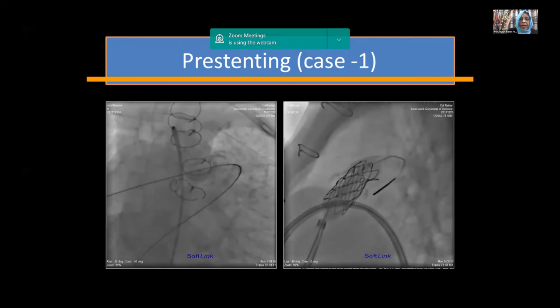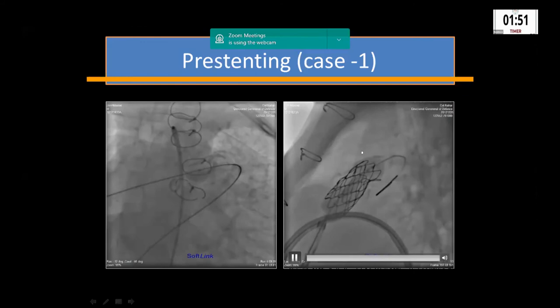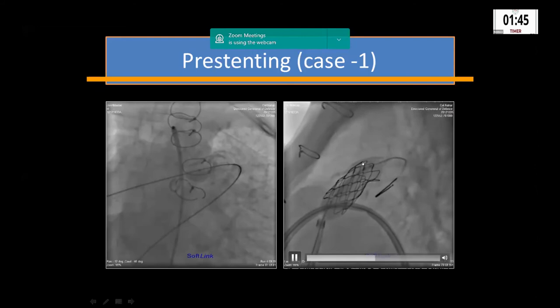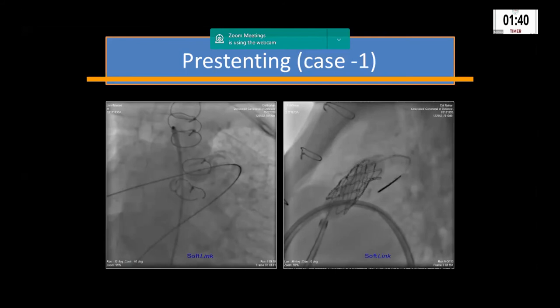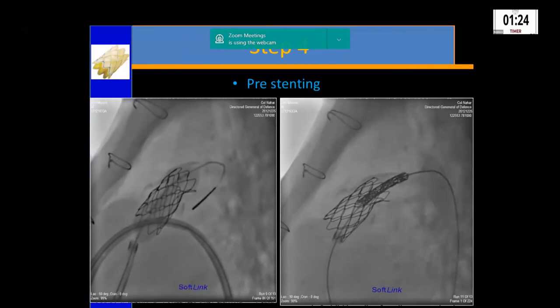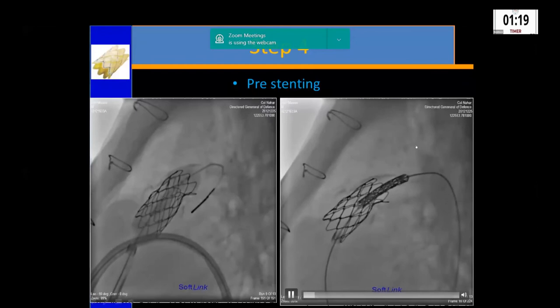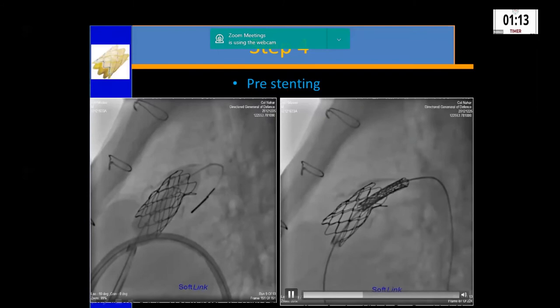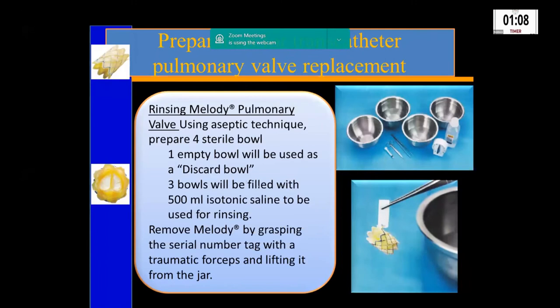We confirmed the coronaries were far away from the balloon. Then we performed pre-stenting — here is the calcification, and we are trying to cover it with a covered stent. You can see this is a beating heart procedure, so during cardiac output from the right heart there is a chance of slight stent displacement during inflation. This stent displaced slightly towards the right ventricle, so we placed another stent to cover the full length. Both are covered within the first stent. Then we proceeded to valve implantation.